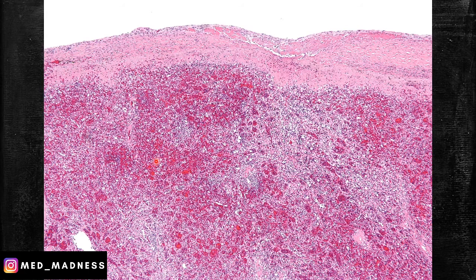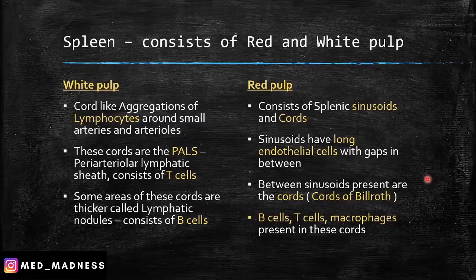This is the histology slide of a spleen. You can notice the red pulp areas here — remember the sinusoids and cords of Billroth — and the white pulp areas. Remember the PALS, which is predominantly T cells, and the lymphatic nodules, which are predominantly B cells.